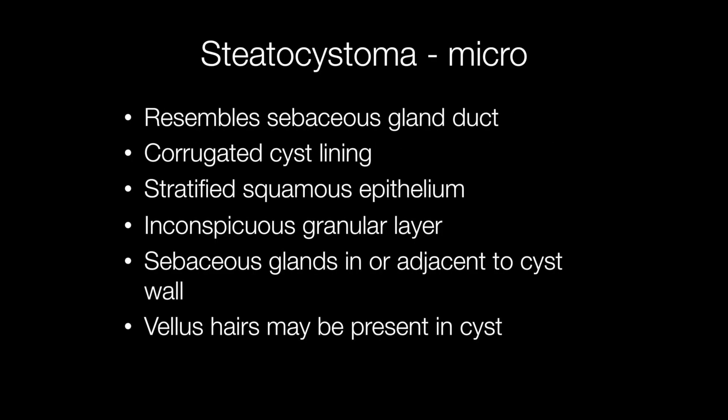Histologically, steatocystomas resemble sebaceous gland ducts. They have a corrugated cyst lining and the lining is composed of stratified squamous epithelium with an inconspicuous or absent granular layer. Sebaceous glands may be found in or adjacent to the cyst wall and vellous hairs may also be present in the cyst.